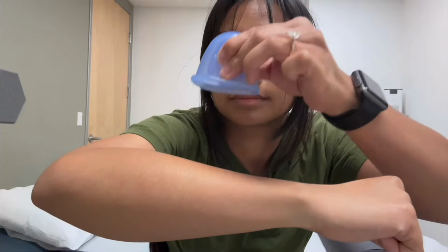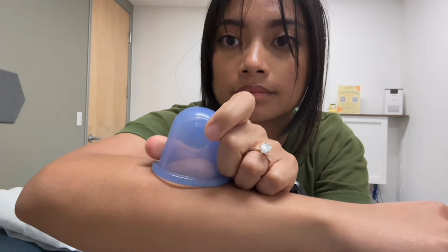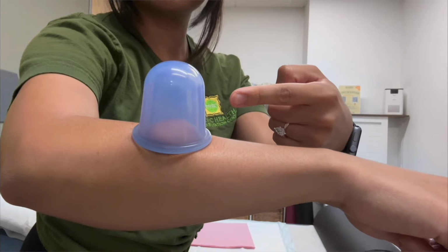Speaking of movement, there are three ways that I like to use cupping as a modality. There's statically, statically with intrinsic movement, and then dynamically, where the cups will be moved along the skin itself. Just to debrief, static is typically where you place it on a desired or specific area. You could leave it on there for 10 minutes. If you are new to cupping, then maybe leave it on there for 5 minutes, remove the cup, assess the skin, and see if you're able to tolerate 5 more minutes.